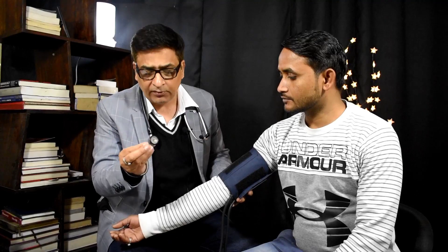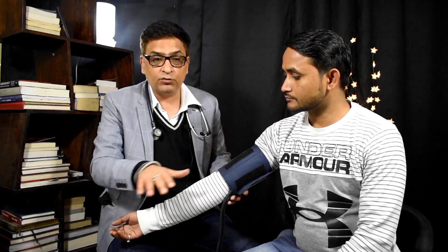Left arm heart ke nearest hoti hai, isliye koshish karo left arm se dekho. Vaise right arm se bhi dekh sakte hain — zyada fark nahi padta, 10 mm ka fark padta hai. Ab jo instrument hai BP wala, woh is level par hona chahiye. Agar patient leta hua hai toh BP instrument bhi bed par rakh do — level par hona chahiye. Teesra — patient relax hona chahiye.